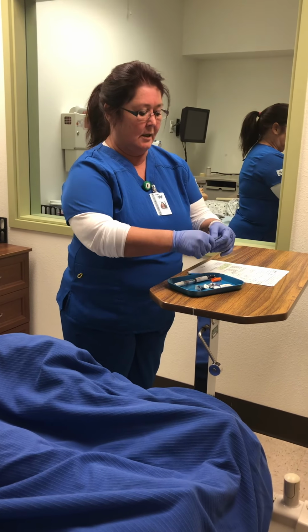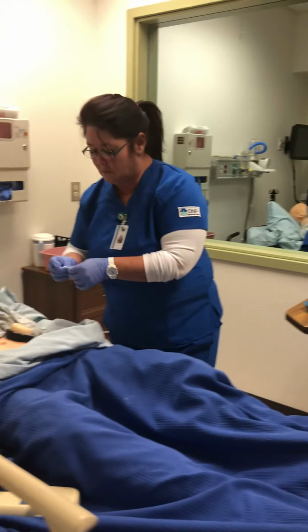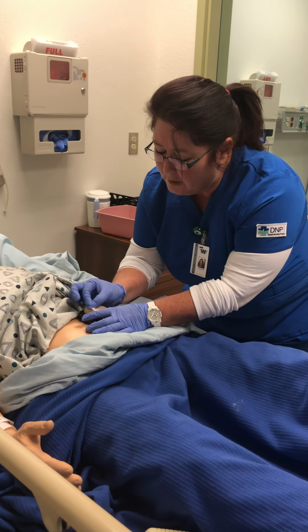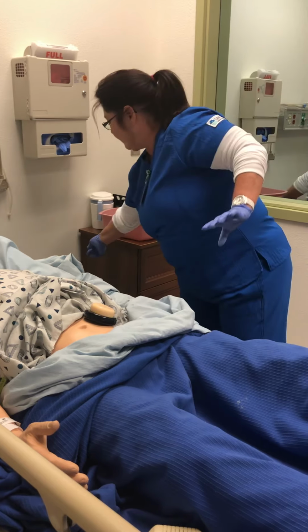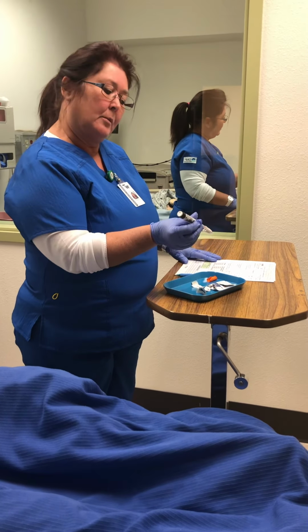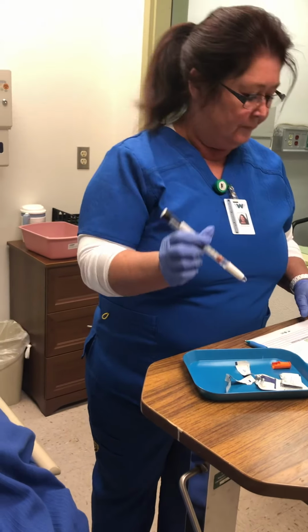So, I'm going to clean the site again. Same way, working from the inside out. And we're going to let that dry 10 to 15 seconds. And I want to double check that I do still have 2 units, that the dial did not move.